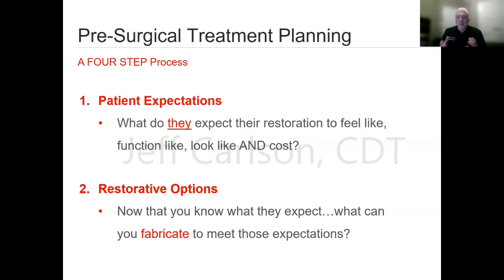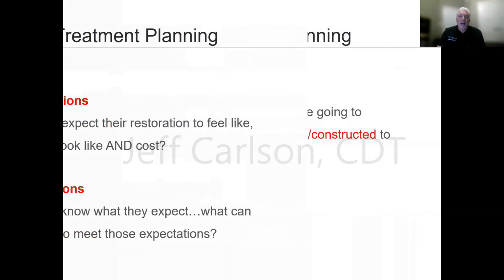And I think most of you realize that if you did just have 2 implants, whether ball abutments, commonly the locator attachments, locator abutments, that there is movement. There has to be. The loads have to be distributed in the edentulous areas and not have all that load going onto just two implants. It's kind of like having a roundhouse bridge on 2 abutment teeth. It's not going to last very long. So again, patient expectations is where everything starts from. It's your destination. And then that's going to help us with the restorative options.